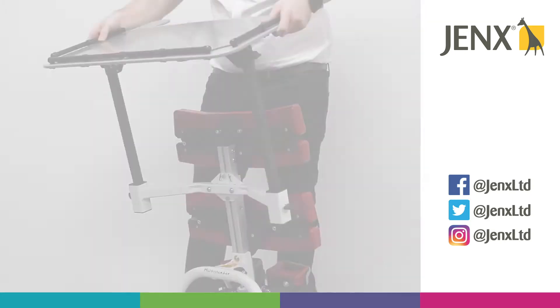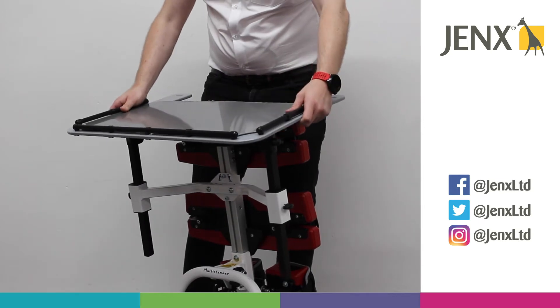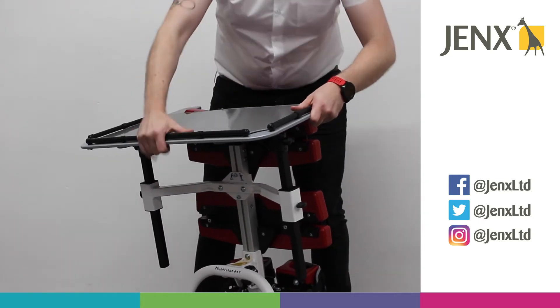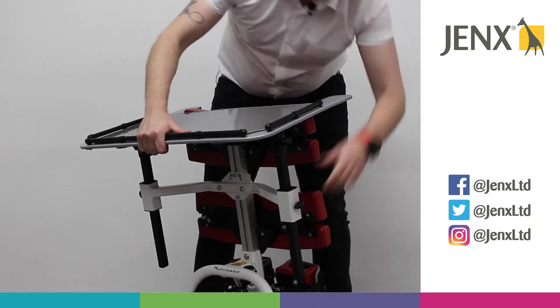We then simply pop the frame into the brackets and lower gently. Once you have the height that you desire, we can tighten the wing knobs on either side of the frame.